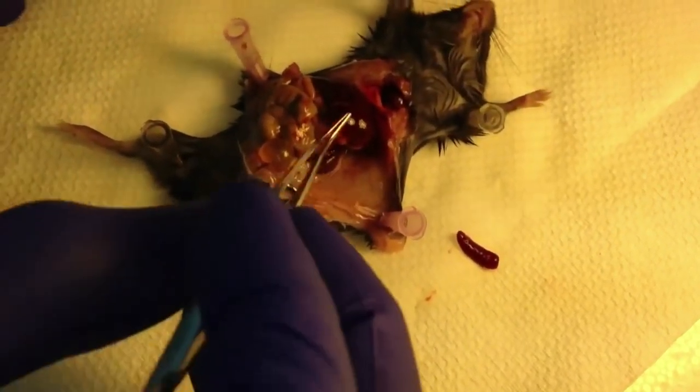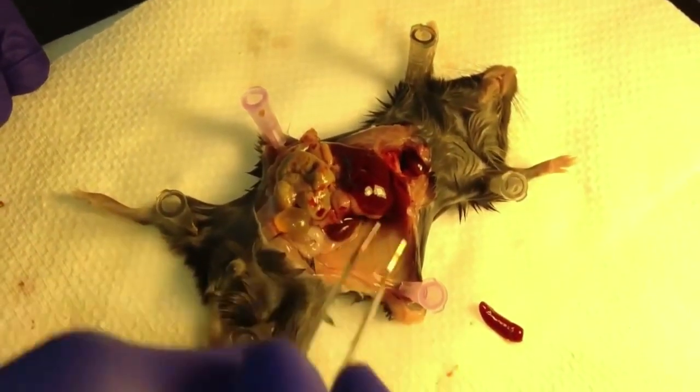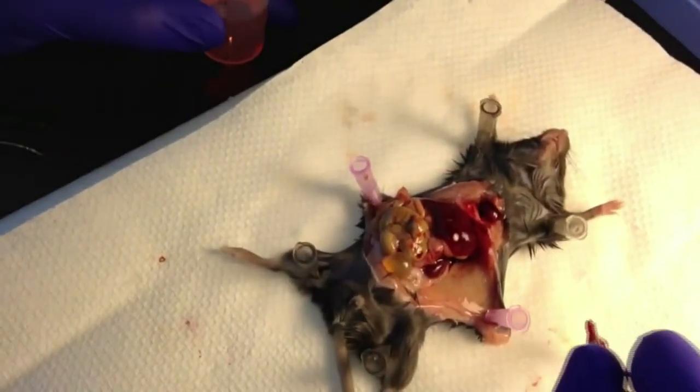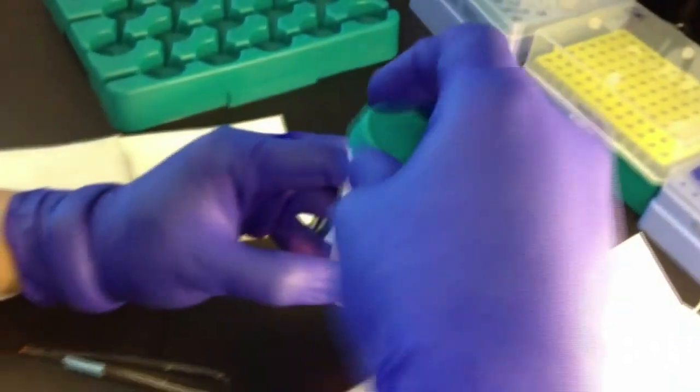Okay, and so now you can still see the kidneys here and the liver here, and the spleen was right here. Now all you have to do is take that, put it into a 50 ml conical full of media. This is complete media, and just drop it in. And that's it.